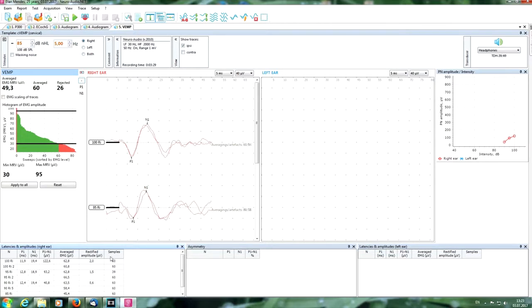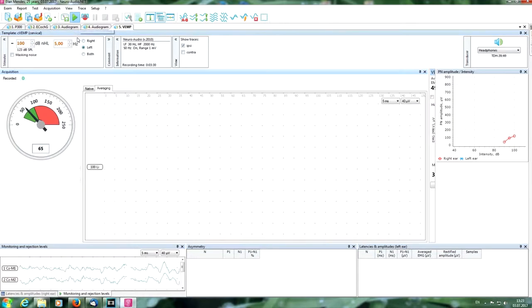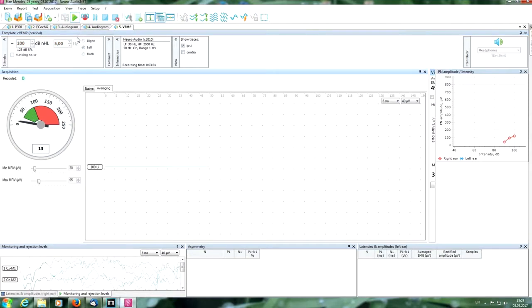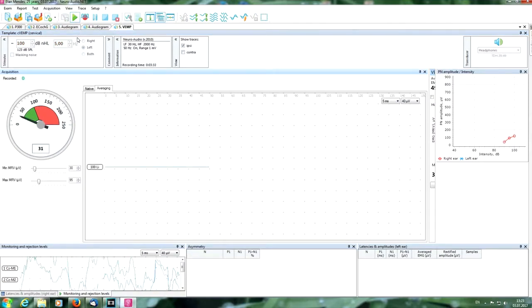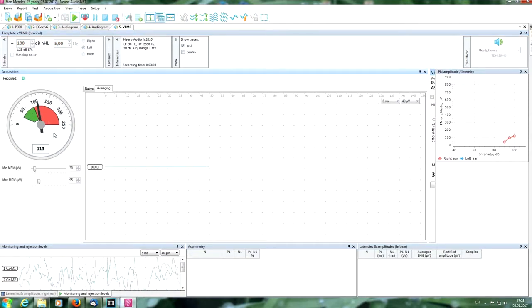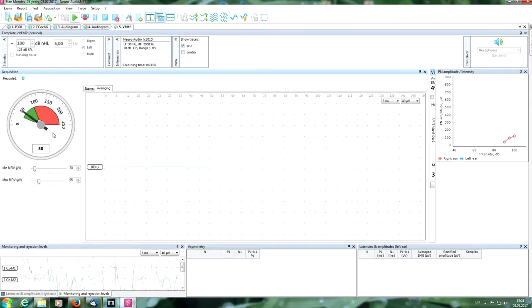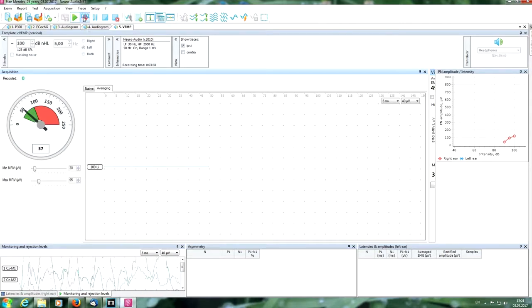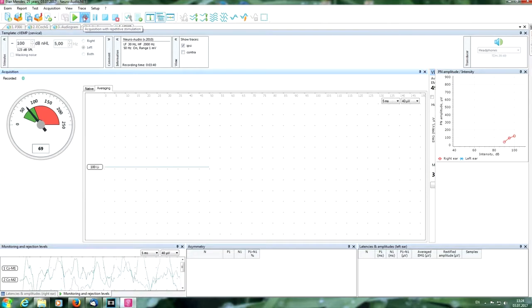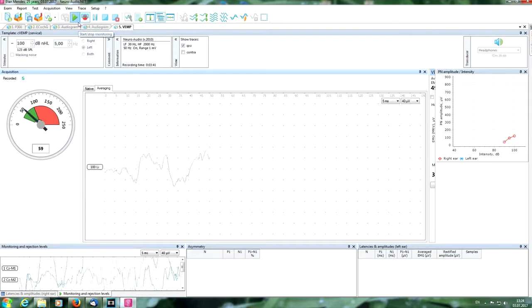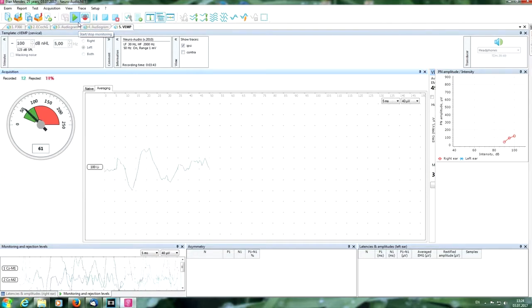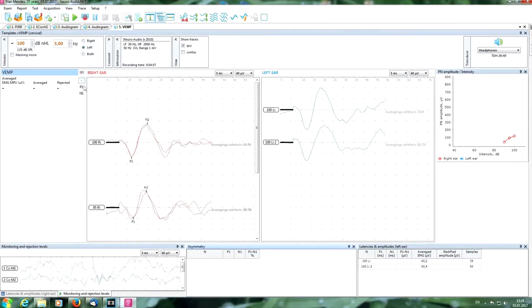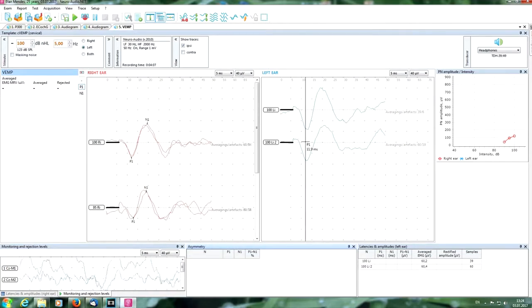Now change the side. Start to teach the patient to contract another side muscles. Okay, and start. We can see the good response now, good reproducibility.